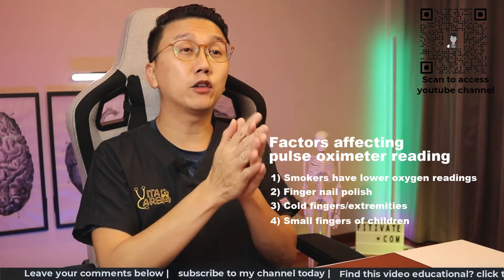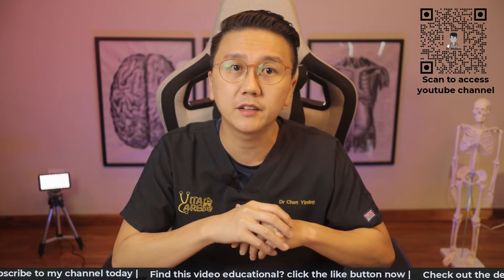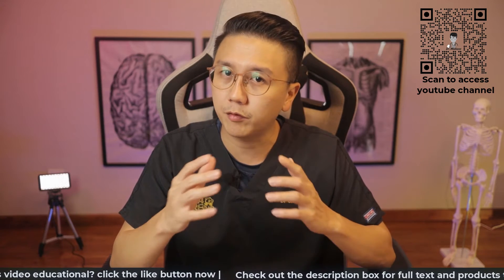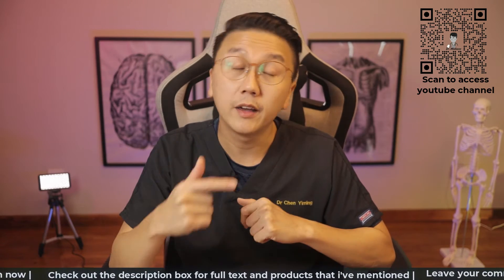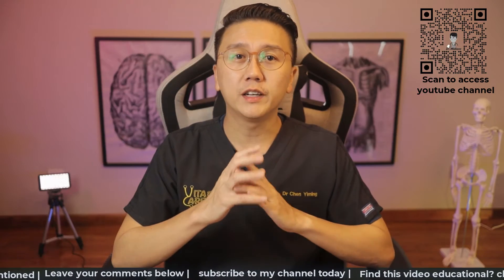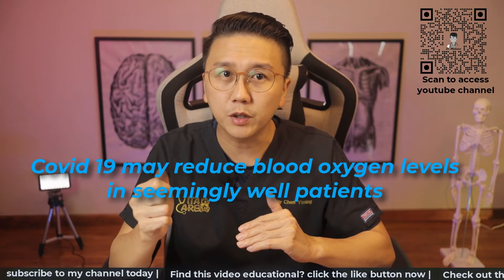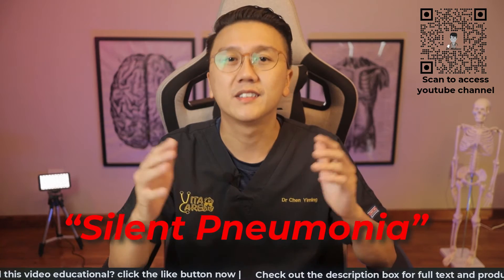Do bear in mind that the pulse oximeter is not 100% accurate. It is generally used in medical settings in hospitals and outpatient clinics for the monitoring of patients who have conditions that can affect blood oxygen levels, such as lung conditions like pneumonia, lung cancer, asthma, and chronic obstructive lung disease or COPD. It can also be used to monitor heart conditions like heart attack and heart failure. The COVID-19 virus can cause blood oxygen to drop to dangerously low levels, sometimes even when you feel relatively well or have no other symptoms — this is termed silent pneumonia.